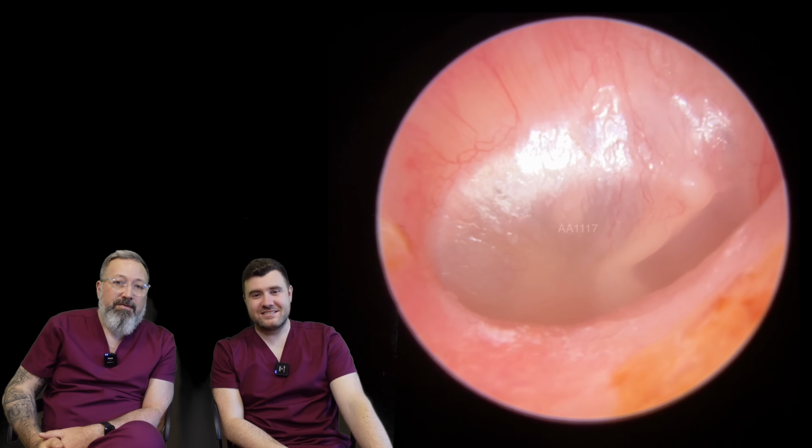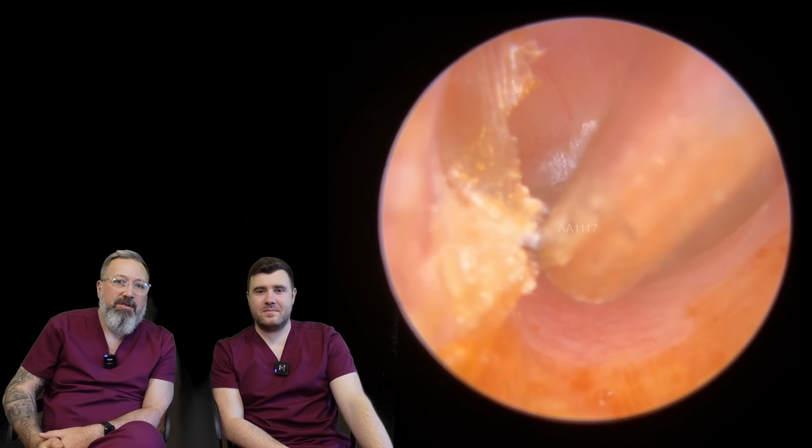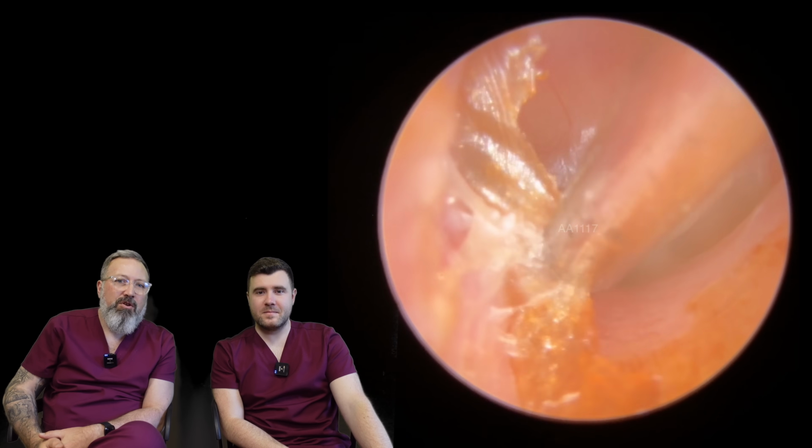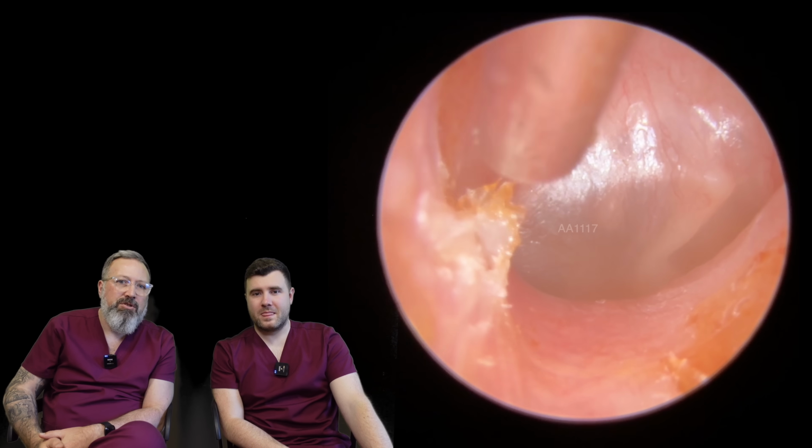But the eardrum looks nice and healthy. You can see there, I've just popped the suction tube in. I see a little bit of a flap of dry skin there, so we're just going to try and lift. I'm not too worried about it. If I can get it off, great. If it stays there, I'll just tell the patient to use a bit of olive oil.